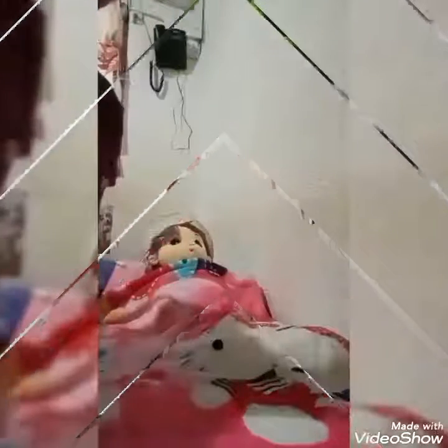Next, explain the procedure to the client. Providing explanation fosters client cooperation and understanding. Then we need to wash our hands and put the gloves on. Position the patient with the head of the bed elevated at least 30 to 45 degree angle.